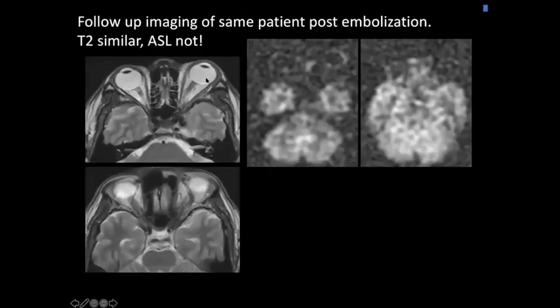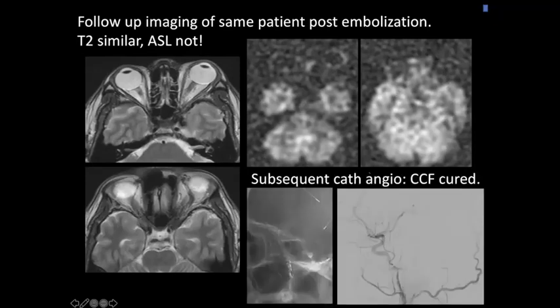Following embolization, he's still proptotic, his cavernous sinus still looks abnormal, and his superior ophthalmic vein is still enlarged. But when we look at our ASL, there's no longer any labeled spins shunting into the cavernous sinus or the superior ophthalmic vein. He goes on to get a follow-up catheter angio.